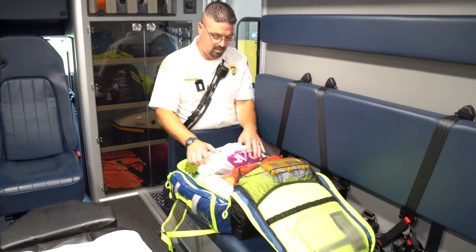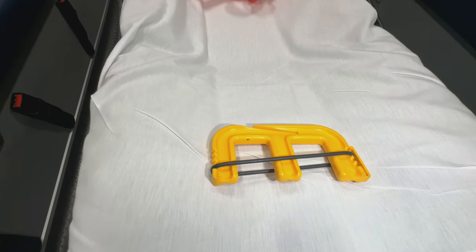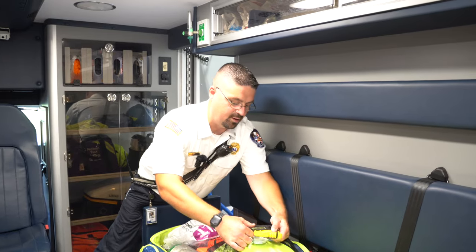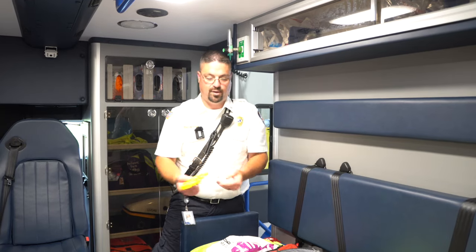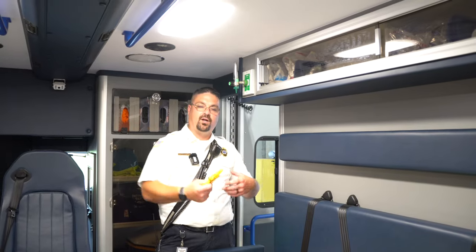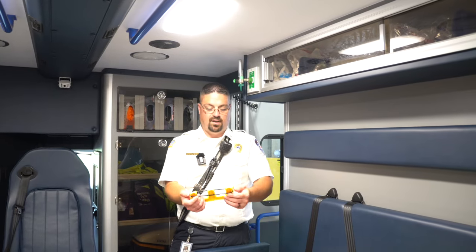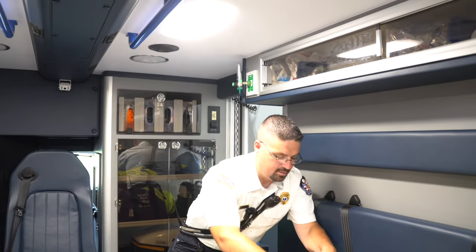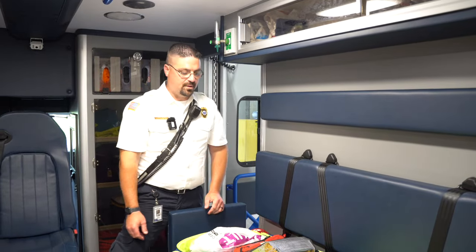I noticed a unique tool that looks like a little W — what are those for? These are for unconscious patients — essentially soft restraints similar to handcuffs. If someone is unresponsive and can't keep their hands on their belly, we don't want their elbows or hands getting caught and pinched while moving. Their wrists slide in and an elastic band keeps them secure so they're not dragging and injuring the patient.